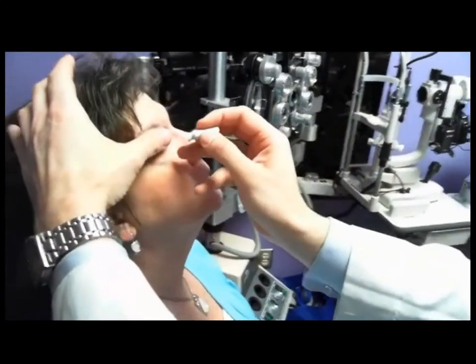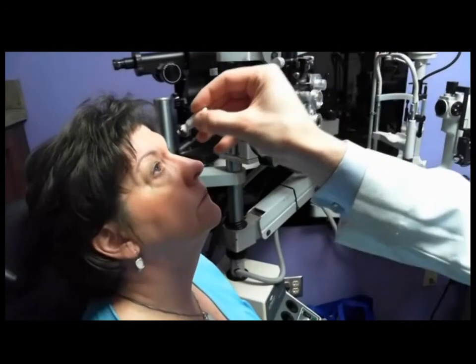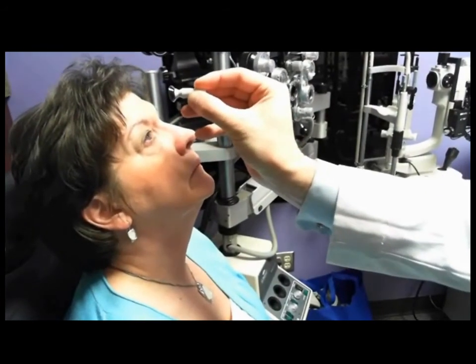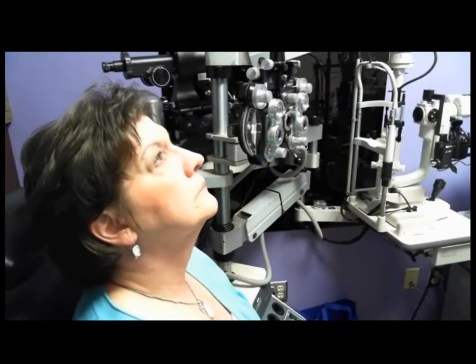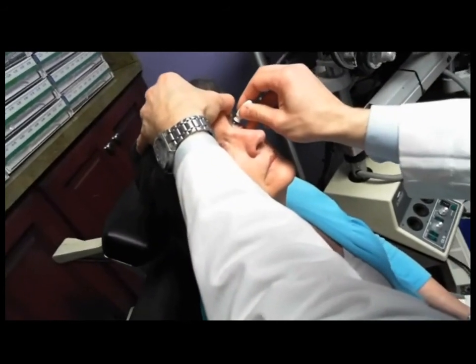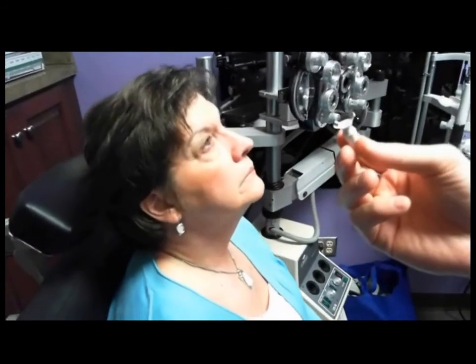Okay, so I'll stand and I'll have Darlene chin up and look straight ahead. And we broke the suction and it came right off. You can see I'm not pulling straight out. If I'm pulling straight out, you won't break the suction. I'm cantilevering the suction device. All right, that's the first one. Let's then make sure that it ends up in the correct trial case. We've all done that incorrectly at some point. And let's go with the other eye. And that one came right off. And it's as simple as that.